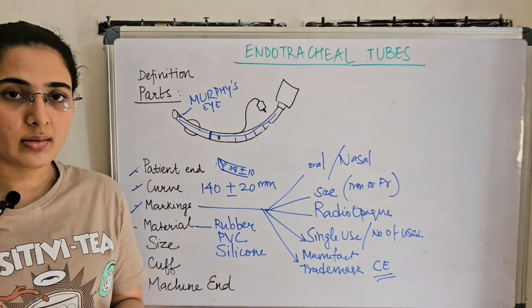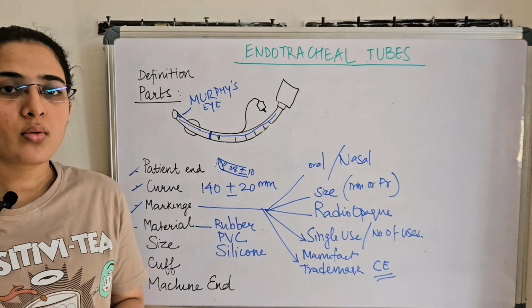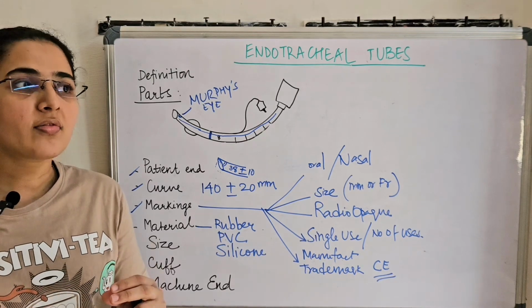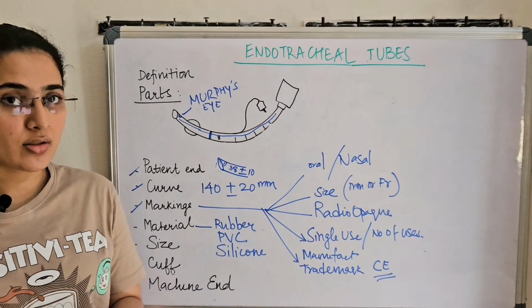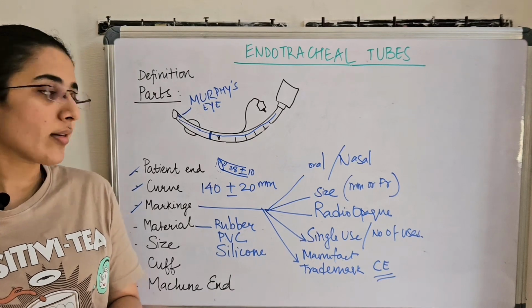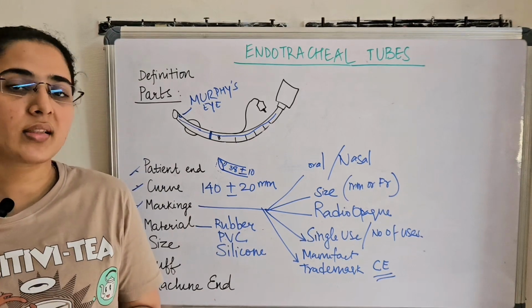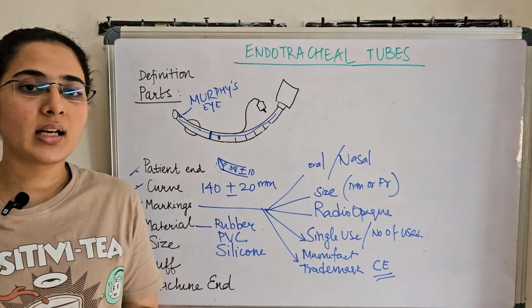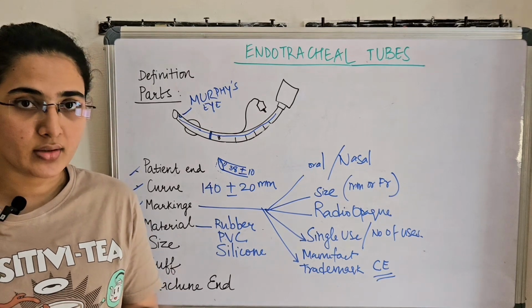because if we select a large size tube than the usual or what is required for the patient, it will have increased incidences of sore throat, post-op. So whenever we have a bigger size tube, the cuff we may inflate it to a lesser extent than what should be actually done. So these may cause certain leaks that may cause ventilator associated pneumonia in the later periods. Also, they will have increased chances of throat pain and all this affiliated to it.